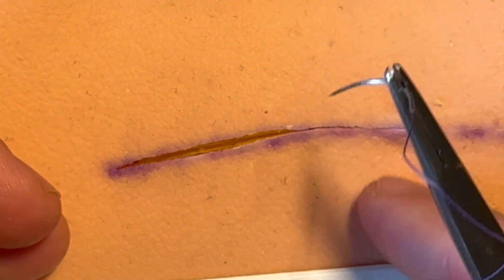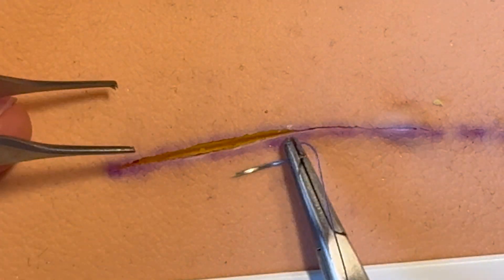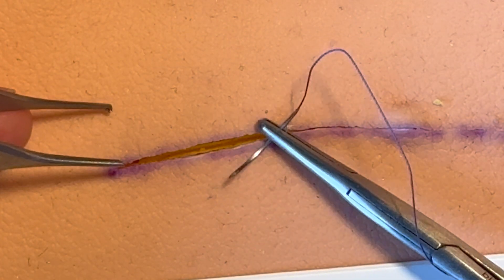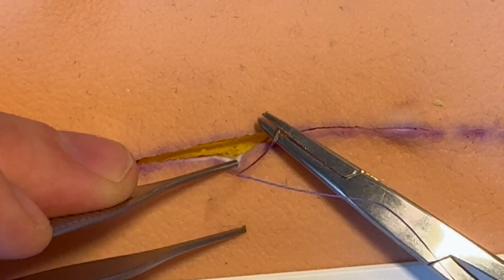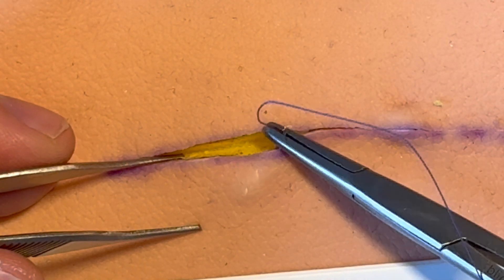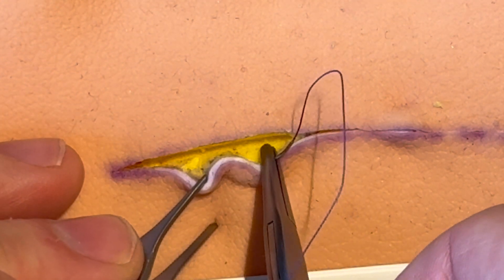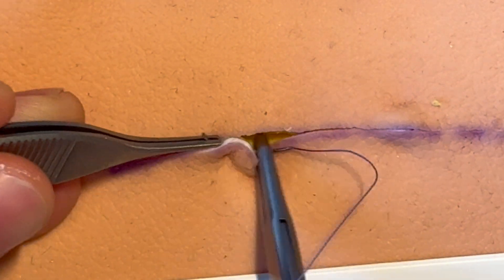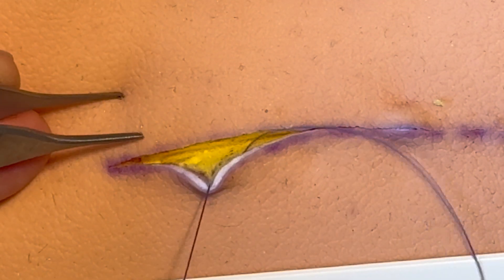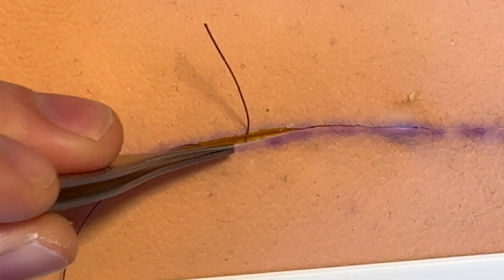That's a much easier way and a much better result. You can actually take it even further — go halfway on the other side and make it a really proper horizontal version. Go in the subcutis, get that little bit of dermis, and go right along — but not so far that you have to bend the needle or can't find it. Go only about half the curvature of the needle, otherwise it becomes difficult. Grab it again and you can see the difference between the entry and exit points — a nice bit of dermis.